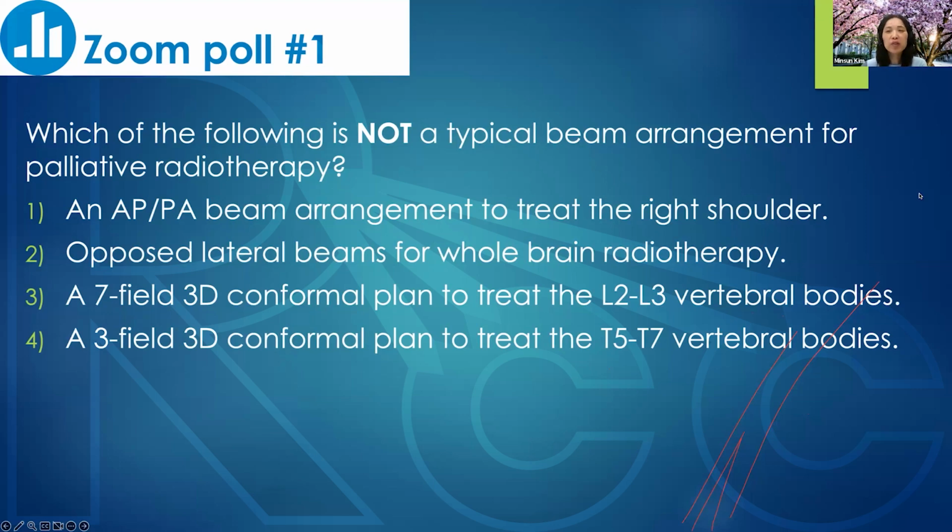I have a quick question, Dustin. How's the treatment time for the conformal arcs? Is it just like as quick as the APPA? And also, what kind of QA do you do for that case?